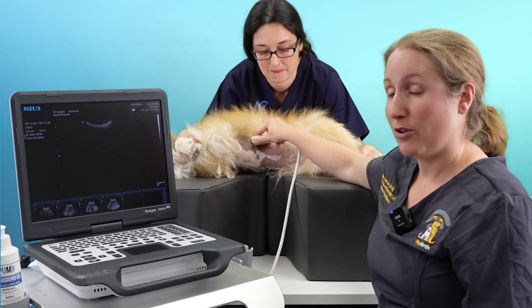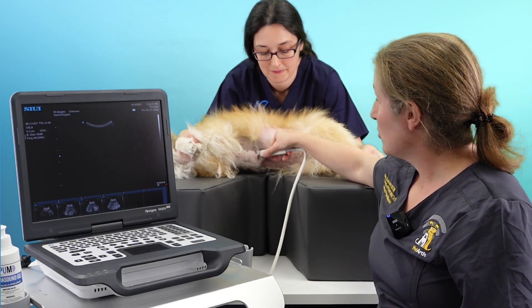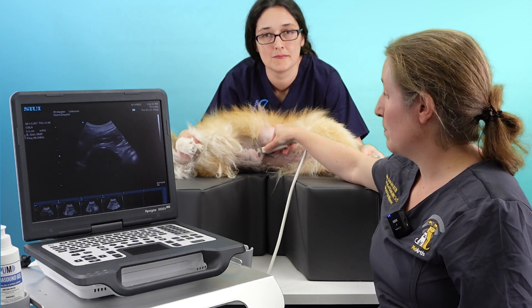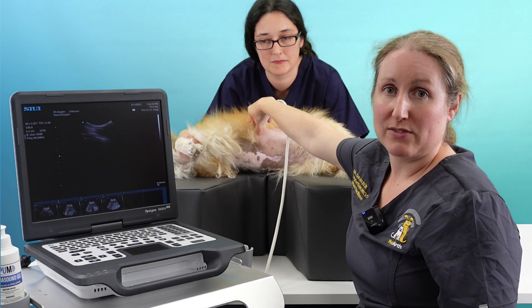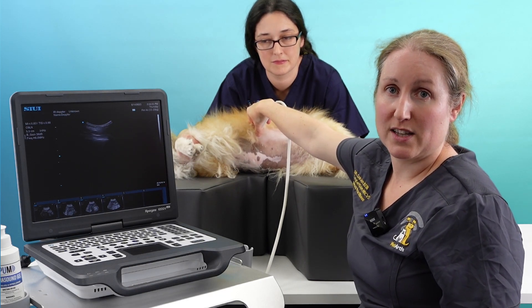The liver of a dog is found in the cranial abdomen, mostly under the rib cage. This is a small dog, so we should be able to see most of the liver from a ventral aspect. With big, deep-chested dogs we'll have to move the probe all the way to the dorsal aspect of the rib cage and probably scan through the costal spaces to see most of the liver.